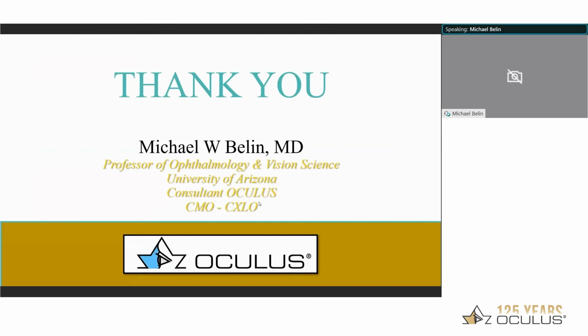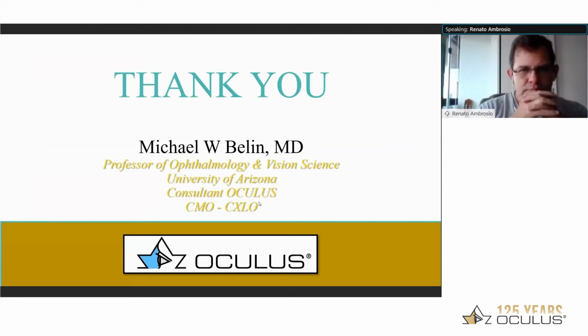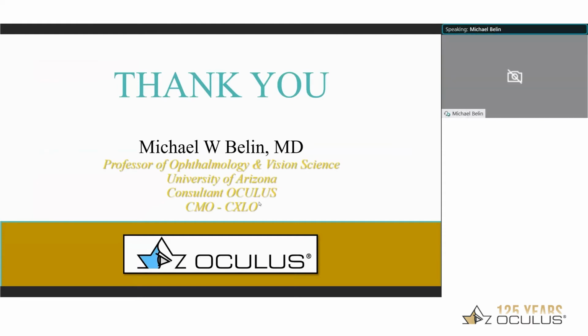Okay. And then another thing you mentioned, you set the baseline examination usually around the first time when you see the patients. Is there any time where there's a reason why you will set the baseline at another examination? Good question. Really, the answer is, if you're doing certain studies, you may want to do comparisons later on. But normally, it will default to that first exam, and that's normally what's done. For most uses, that's the best application.